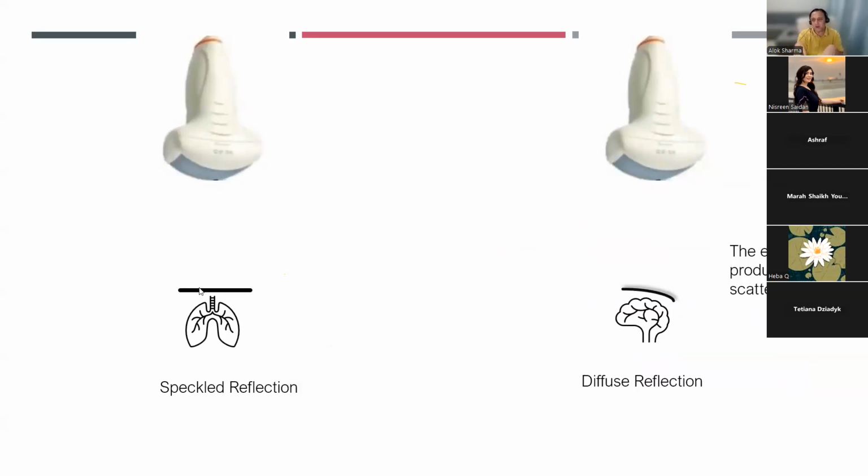The interaction of sound waves when they enter the lung, it's not tissue that you're seeing. You're seeing the interaction of ultrasound waves with the alveolar air, with the interstitial fluid, and that ratio governs patterns. On the other hand, if you look at the brain and the structure, it's very tissue-like, but it's got a very irregular structure.